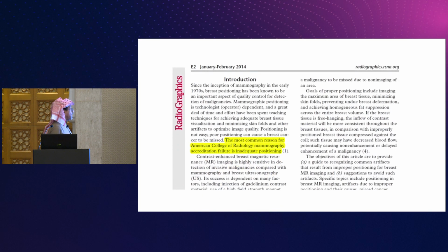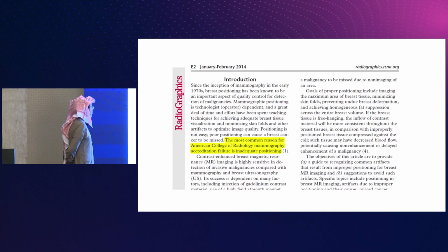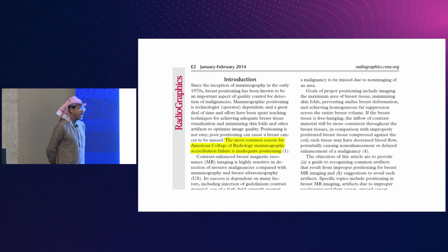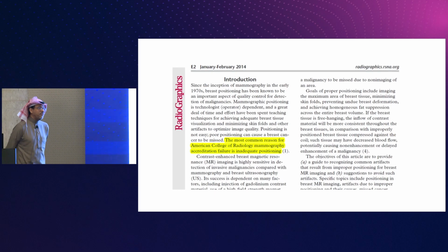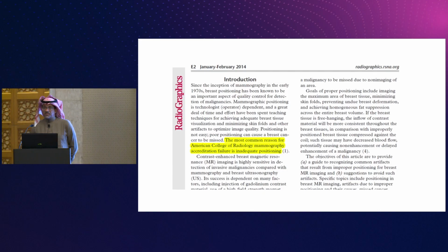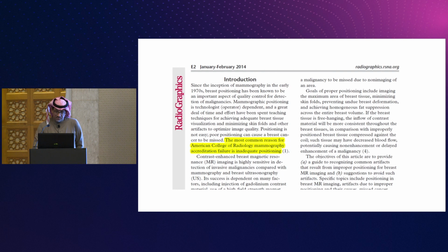What is it? The most common reason for American College of Radiology mammography accreditation failure is inadequate positioning. Failure of the exam. It's not artifact.